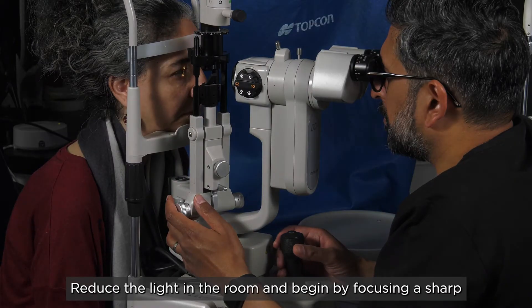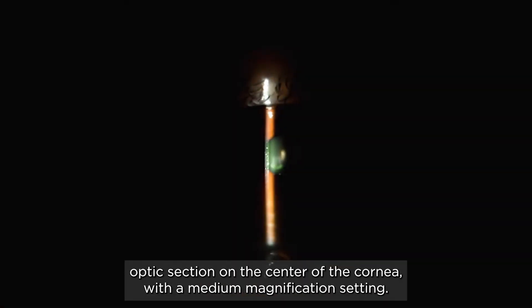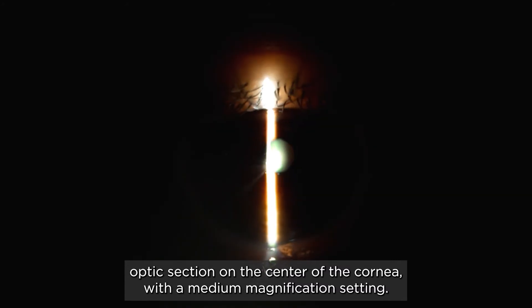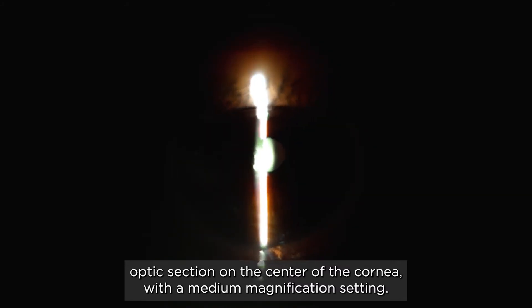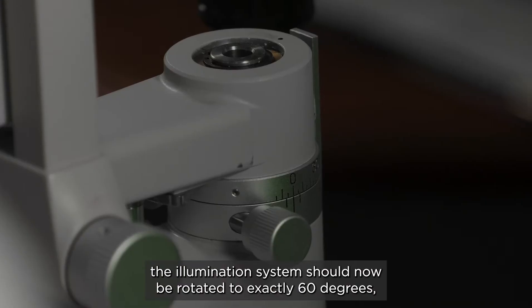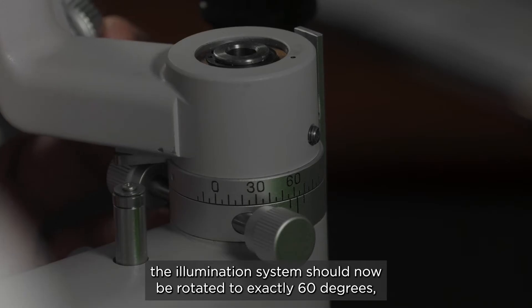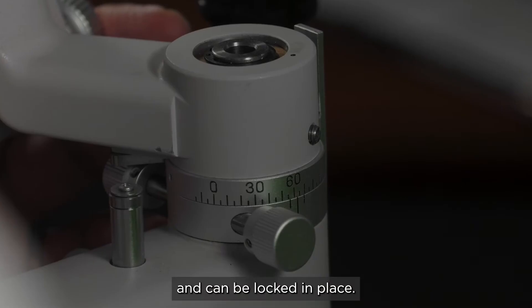Reduce the light in the room and begin by focusing a sharp optic section on the centre of the cornea with medium magnification setting. With the observation system straight ahead, the illumination system should now be rotated to exactly 60 degrees and can be locked in place.